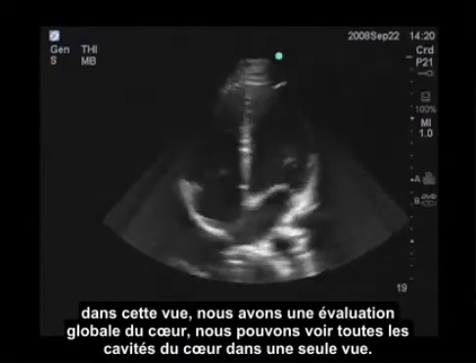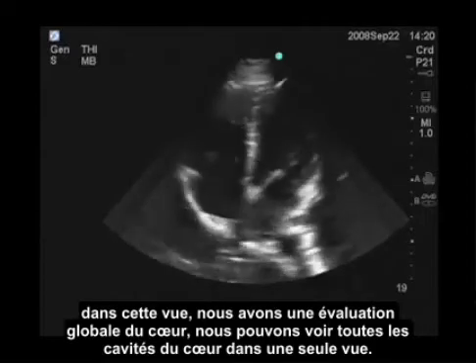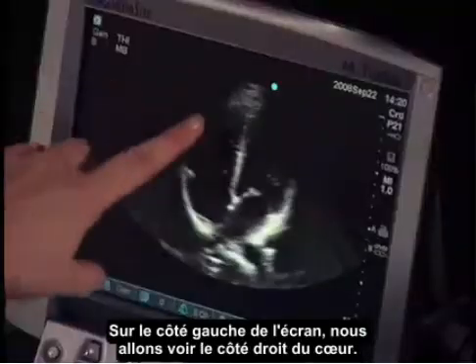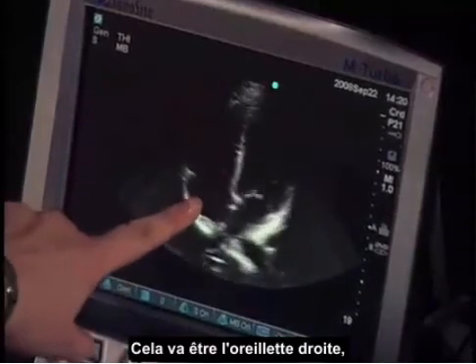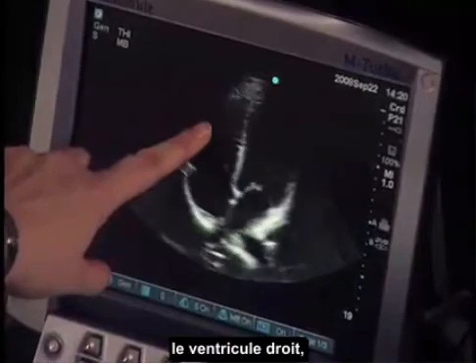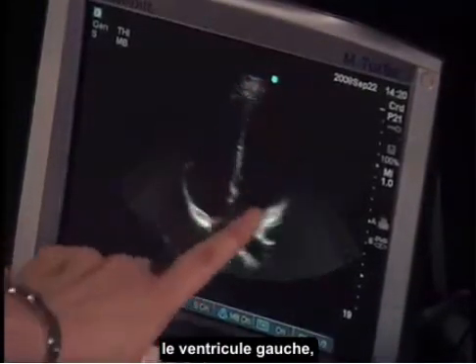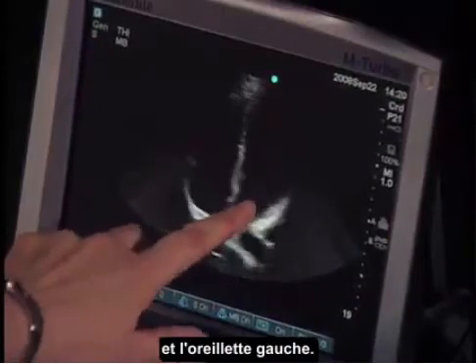On this view, we have an overall assessment of the heart — we can see all chambers of the heart in one view. On the left side of the screen, we're going to see the right side of the heart: the right atrium, tricuspid valve, and right ventricle. Then the interventricular septum, left ventricle, mitral valve, and left atrium.